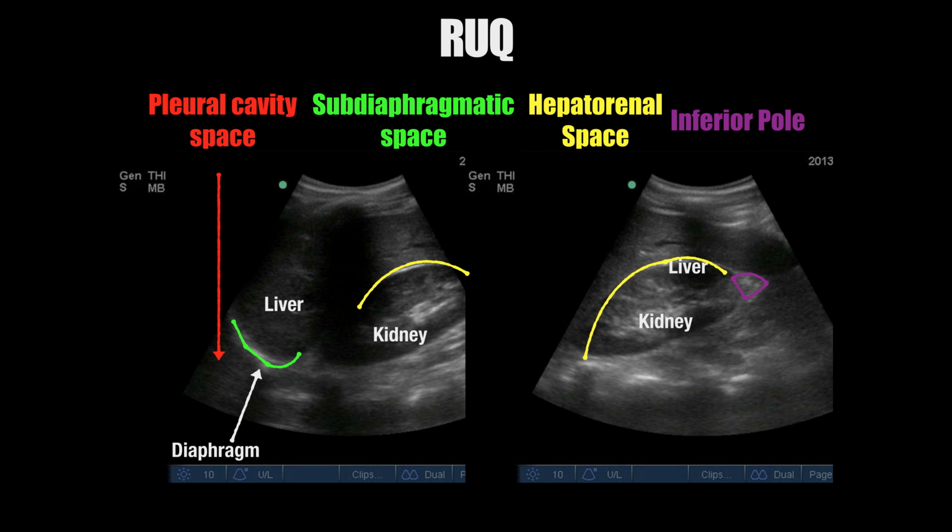I will highlight on the bottom right that the inferior pole of the kidney is also a particular point of emphasis in terms of visualizing. I've seen a number of cases where there's fluid in the belly located solely right at that inferior pole, for some reason, the way the ligaments of the belly shape out force fluid into this region. So make sure you're seeing that Morrison's pouch above the liver, between the diaphragm and the liver, and then that inferior pole, and fan all the way through.